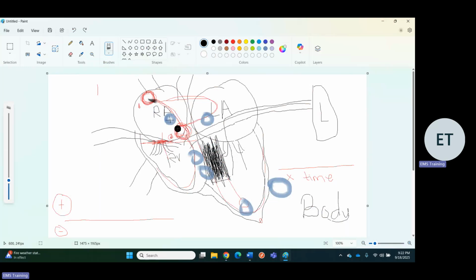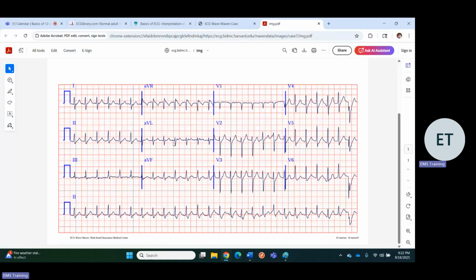You see it originates here and it causes ventricular depolarization, but at the same time, the atrial activity does this. So briefly, the atrial activity goes towards that lead, and when it goes towards the lead, it's a positive deflection, but it's occurring after the septum activates, which means it's going to occur after the QRS complex starts. So this part here looks like an AVNRT. See?